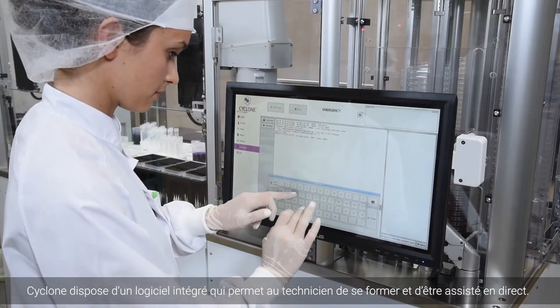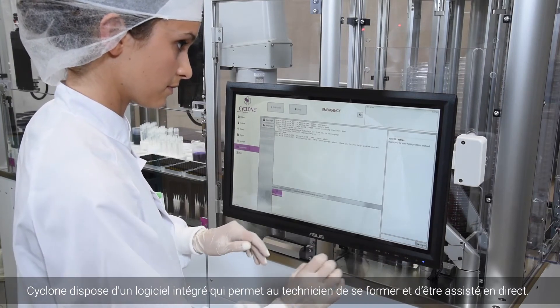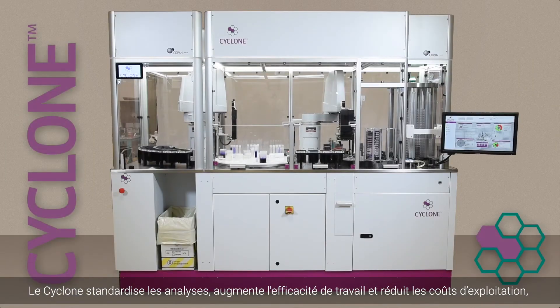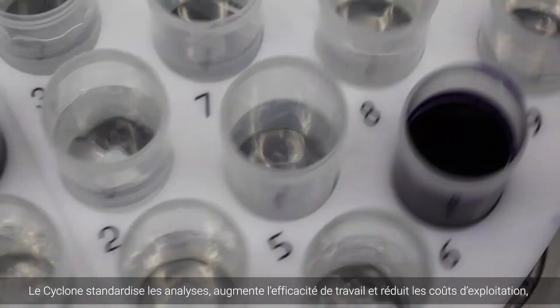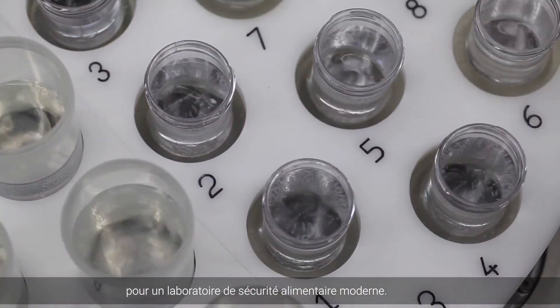Cyclone features an integrated chat window that connects to a live technician for on-demand training and assistance. The Cyclone standardizes sample testing, increases workload efficiency, and drives down operating costs for the modern food safety laboratory.